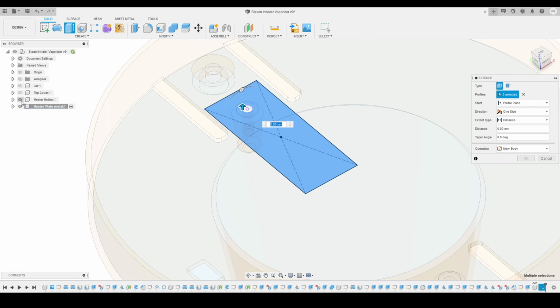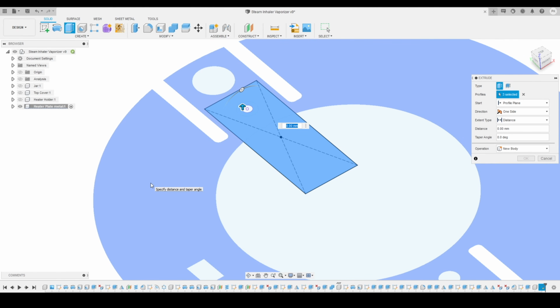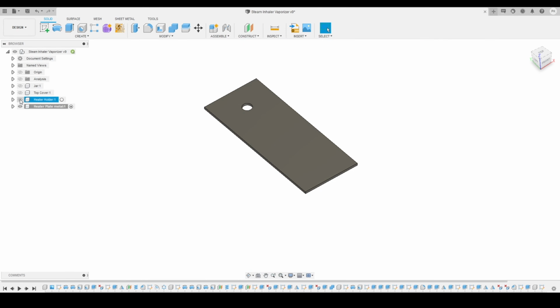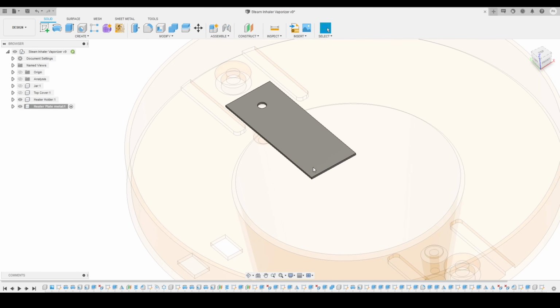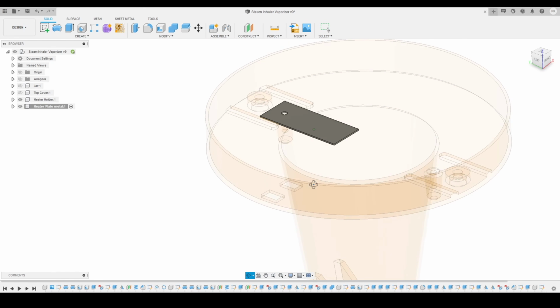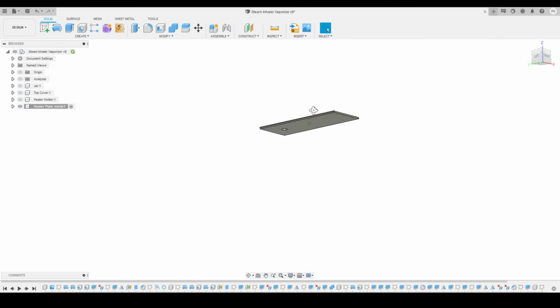I will make sure that I have selected all the profiles. We'll give it a thickness. Now I will extrude it by a particular distance, maybe 0.5 is the thickness, and press OK. Here you can see. Now what I will do is finish this heater holder plate. Since it's a sheet metal component, we'll just turn off the other components.